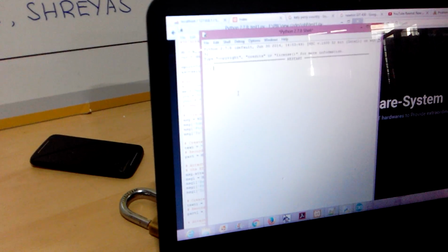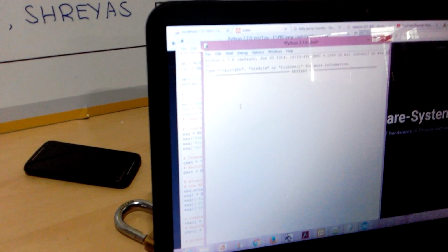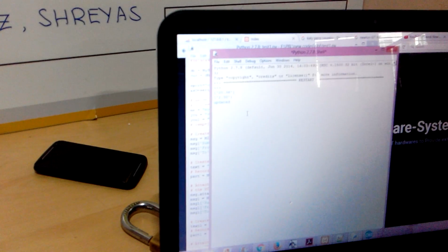The Python script will enable us to save the data into the database table, which we have maintained locally. As you can see here, this is the temperature, this is the pulse variations. This is getting updated every time. Now we will see it in the local database server. This is our local database server, temperature and pulse variation.